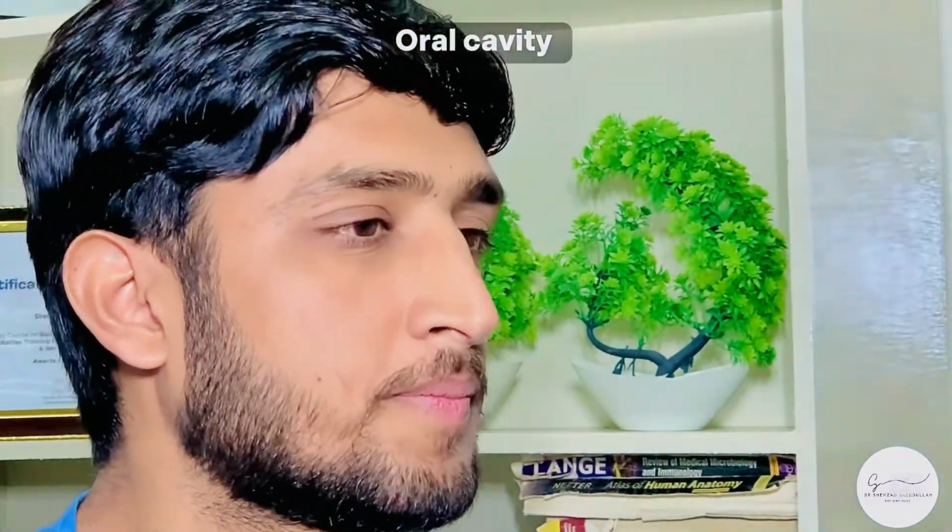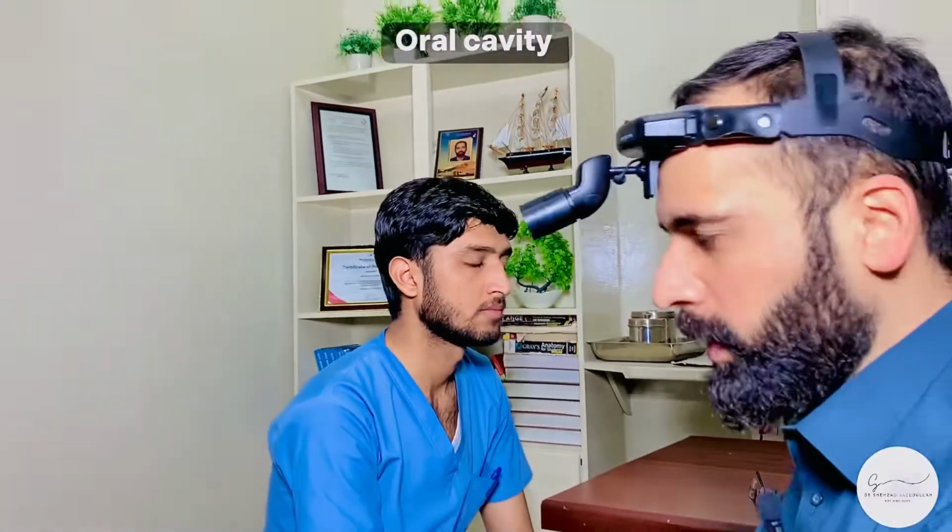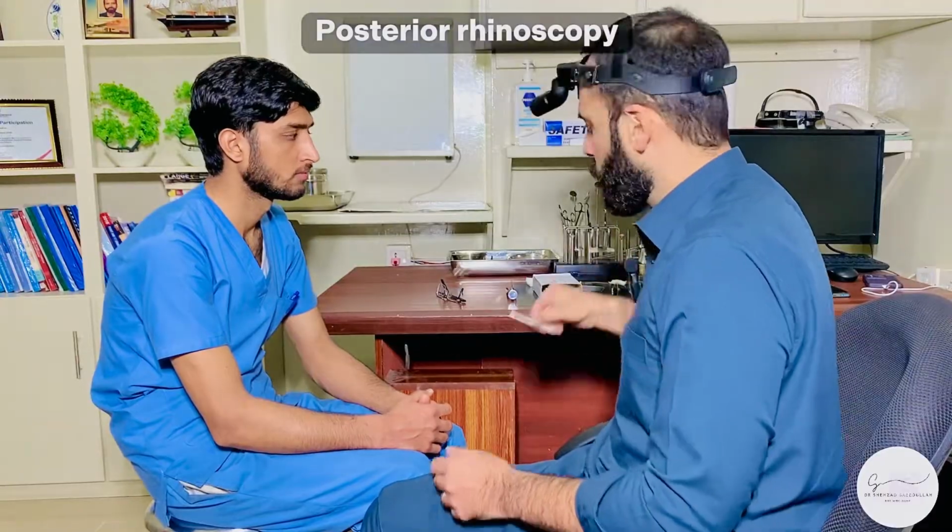Right side. Okay. After assessing the sensations of the hard palate, after assessing the palatal sensations, now we are going to do the posterior rhinoscopy. So for that, you need a posterior rhinoscopy mirror.